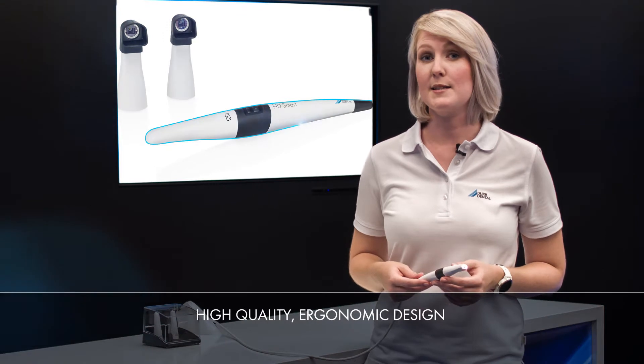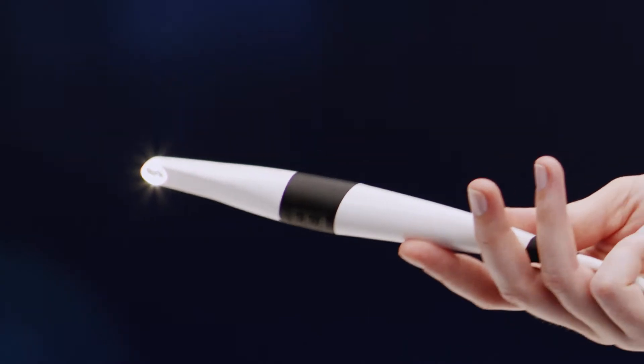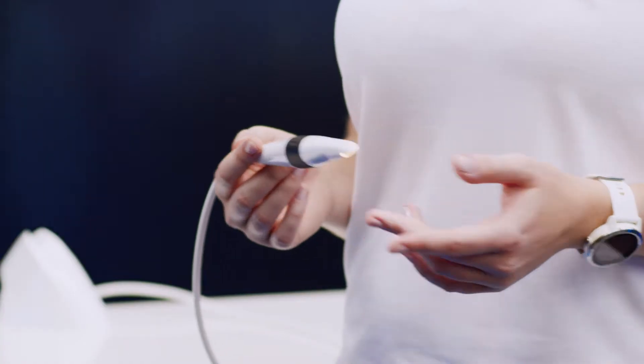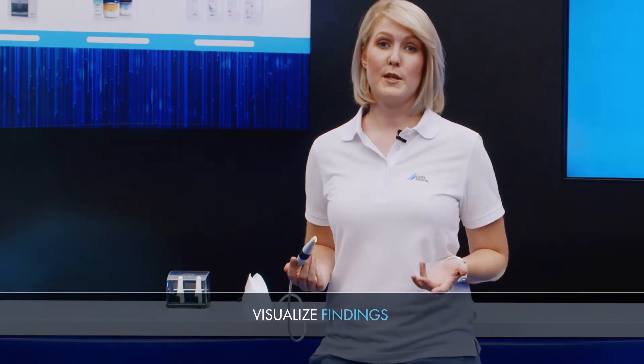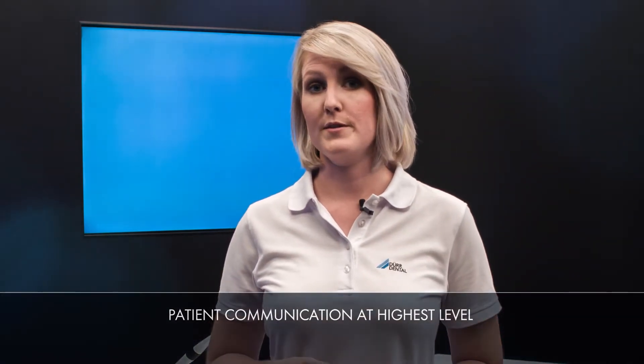The Vistacam iX-HD Smart impresses with its high quality user-friendly design. Primarily thanks to the narrow camera head you can take images of practically any angle in the patient's mouth. Live images which the patient can watch in real time on the treatment unit show gum diseases and caries while also providing a record of how treatment is progressing. So in many cases the patient can actually see for themselves where the problem is. The result is complete transparency in terms of patient treatment and care.